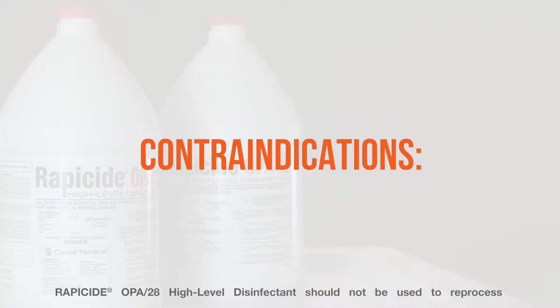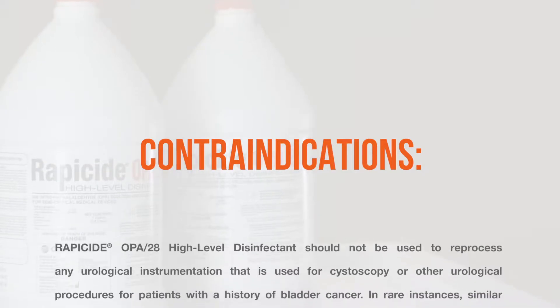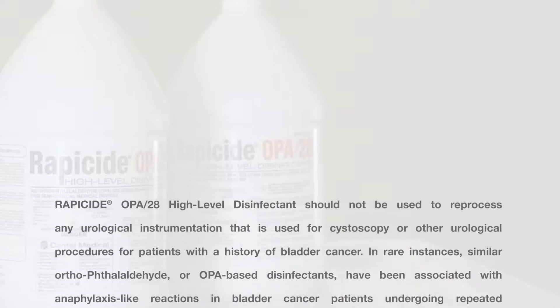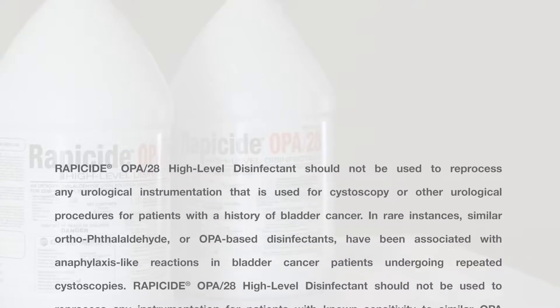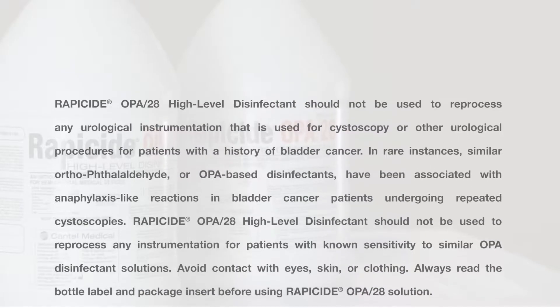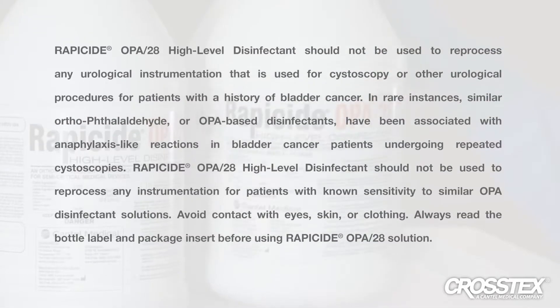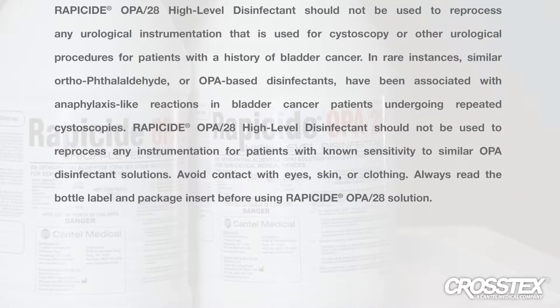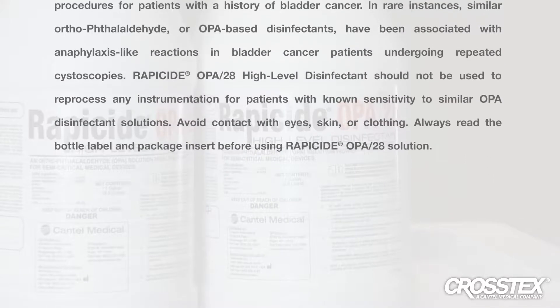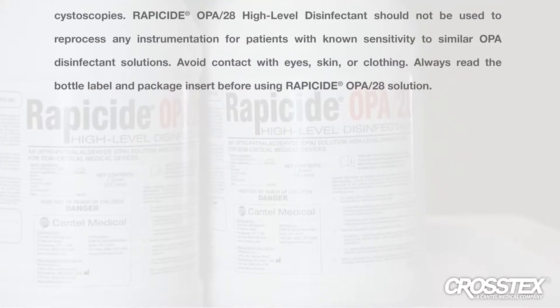Rappaside OPA28 high-level disinfectant should not be used to reprocess any urological instrumentation used for cystoscopy or other urological procedures for patients with a history of bladder cancer. In rare instances, similar orthophthalaldehyde or OPA-based disinfectants have been associated with anaphylaxis-like reactions in bladder cancer patients undergoing repeated cystoscopies. Rappaside OPA28 should not be used to reprocess any instrumentation for patients with known sensitivity to similar OPA disinfectant solutions.